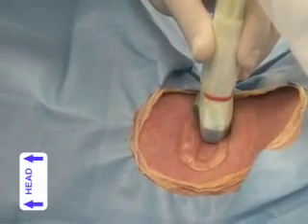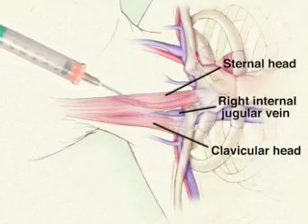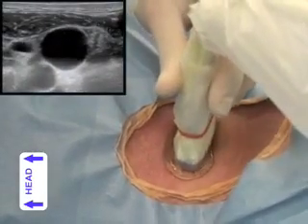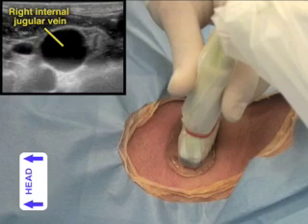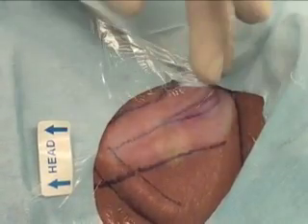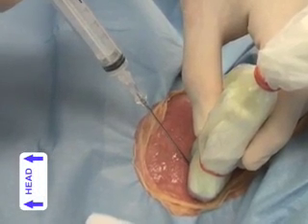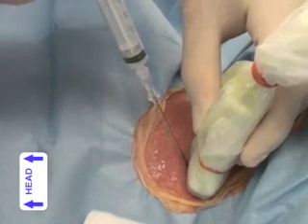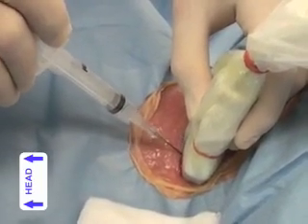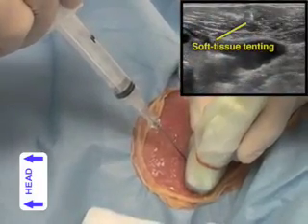This demonstration illustrates the use of ultrasound guidance in a central approach in which the needle is inserted between the two heads of the sternocleidomastoid muscle for internal jugular cannulation. Position the transducer so that the internal jugular vein is centered in the ultrasound image and between the two heads of the sternocleidomastoid muscle. Gently palpate the skin to confirm that the puncture will be between the muscle heads. Using an 18-gauge needle, puncture the skin at the center of the transducer, being careful not to damage the sterile sheath, and advance the needle at a 45-degree angle. As you advance the needle, maintain negative pressure in the syringe until the vein is punctured. When the needle passes caudally underneath the transducer, the needle as well as soft tissue tenting can be viewed on the ultrasound screen.